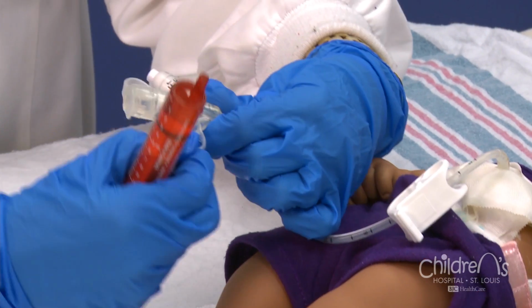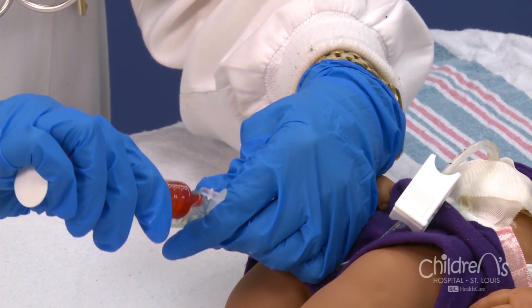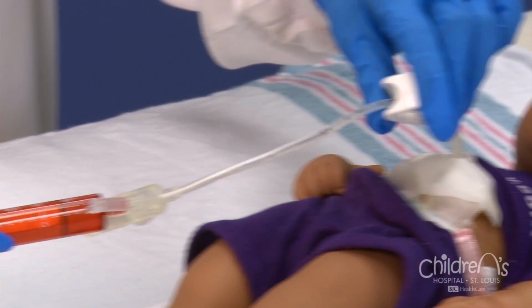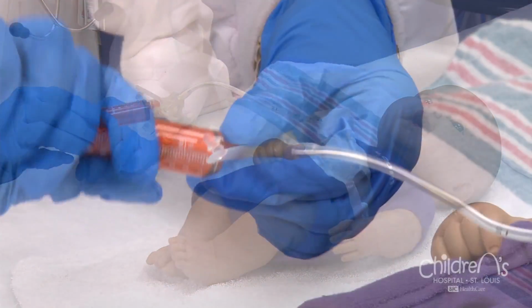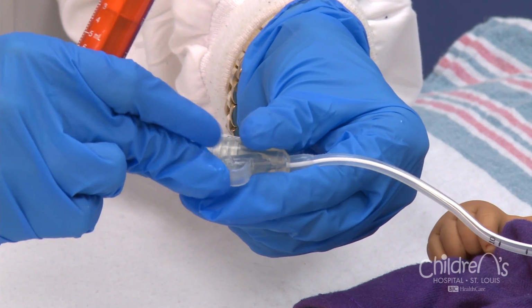Put the medicine syringe into the smaller port. Unclamp the tube and slowly push medicine into the tubing. Clamp the tube. Disconnect the medicine syringe and close the medication port on the tube.